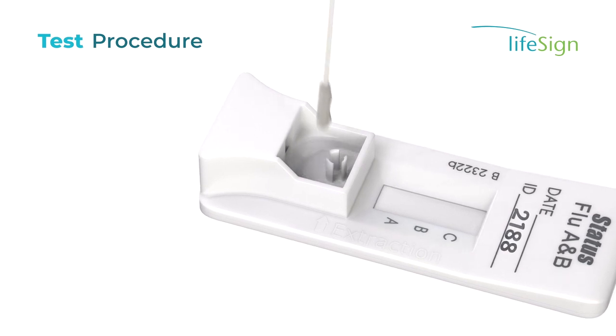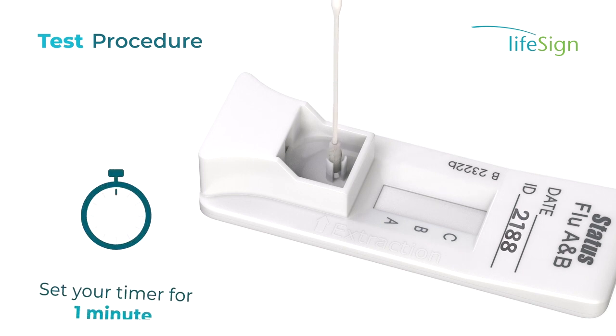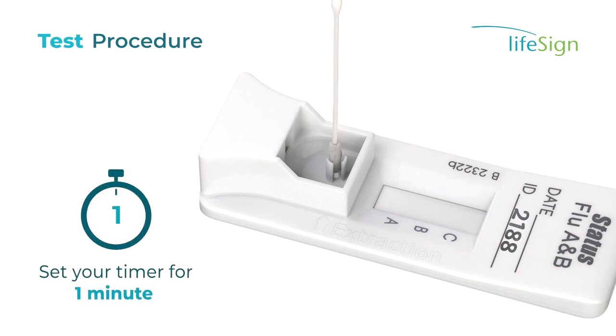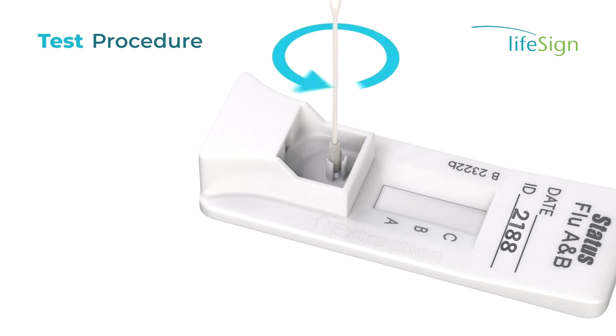Squeeze the reagent capsule to dispense all of the reagent into the extraction well of the test cassette. Insert the patient specimen swab into the prong swab stand in the extraction well. Rotate the swab 3 times in the same direction to mix the sample. Allow the swab to stand in the device to incubate and set a timer for 1 minute. Then, rotate the swab again 3 times in the same direction. Remove and discard the swab.